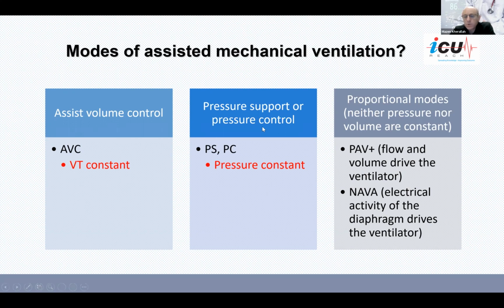In pressure support or pressure control, the pressure is constant and then the volume is dependent on the patient's resistance and compliance.